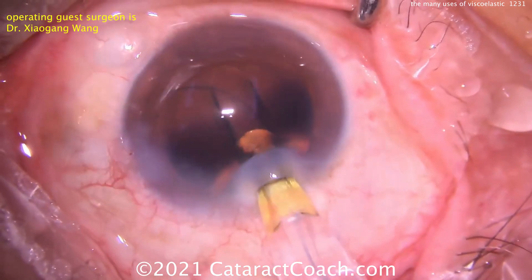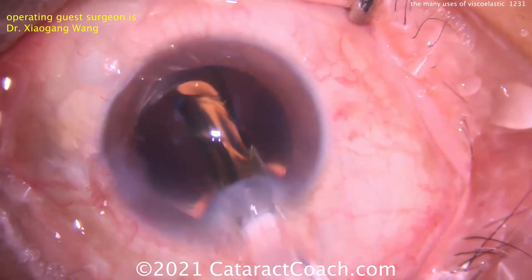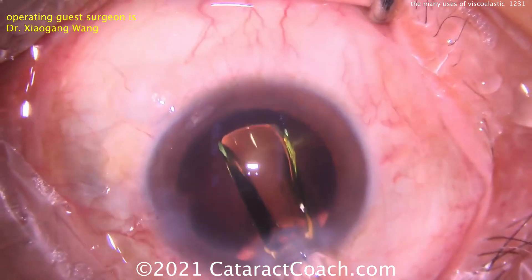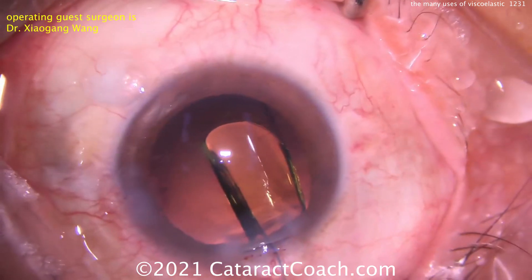A three-piece lens is going in. The leading haptic looks pretty good. Then we've got the optic coming out, opens up pretty nicely. Now we've got to get the trailing haptic in, going in slowly. And look at the incision — viscoelastic is leaking out.